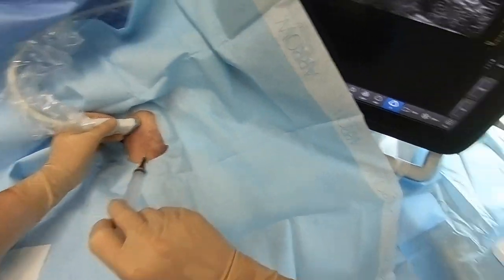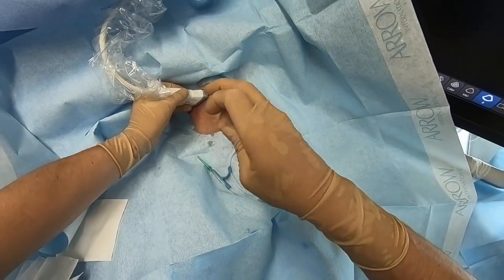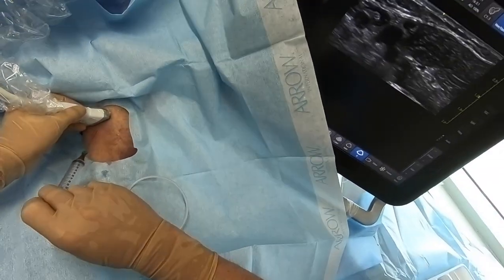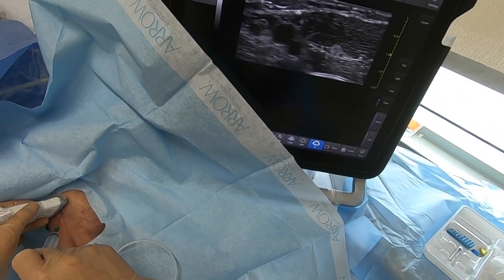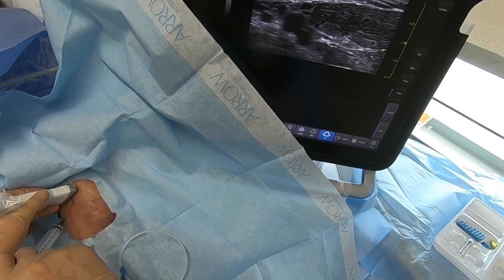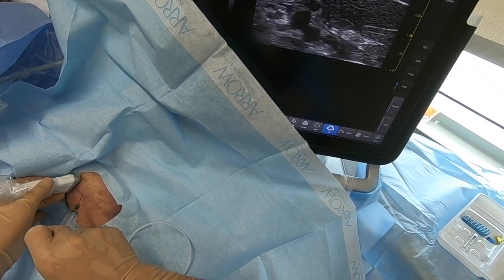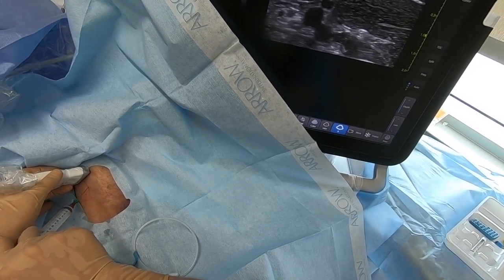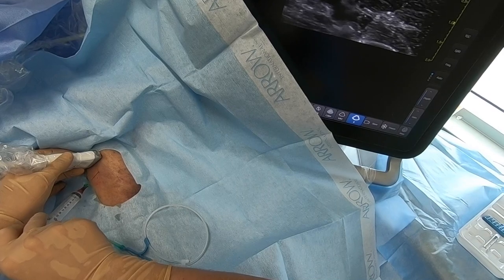We'll now make our access attempt using the introducer needle that comes in the kit. This is quite small compared to other devices — it's only 21 gauge, just like a micropuncture needle. You don't need a syringe on it, but for any difficult vein it is helpful to have. It gives you immediate feedback of when you've entered the lumen of the vessel compared to just watching for passive reflux of blood. This is a small needle, so that comes slowly. With active aspiration, you get much quicker feedback, even when you have poor visualization. Some people find it a little unwieldy to have the syringe, but it tends to help. We're using the same technique as always — continuously following our needle tip. See the separate video for that technique.